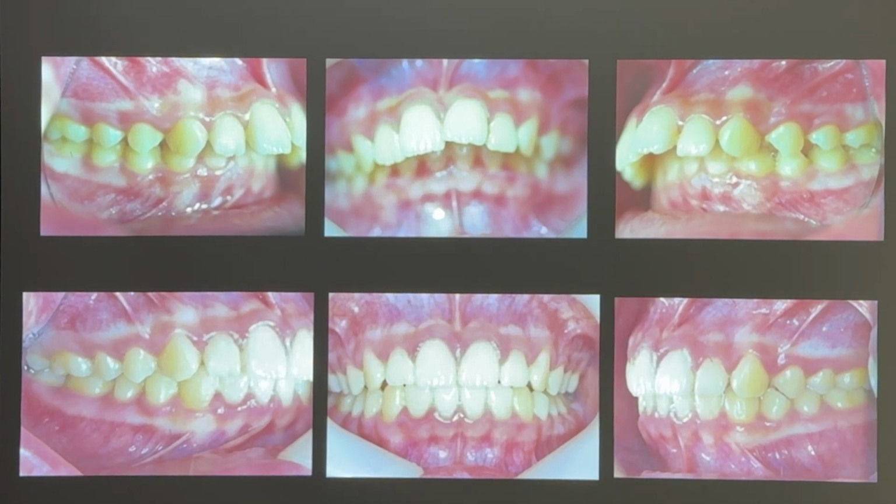Or sometimes, your eyes are very, very beautiful. And then I keep this lip seal with my hand, with my finger. The reason I attach my hand to the patient's face to make lip seal is to do it without any notice. You can try to do this.